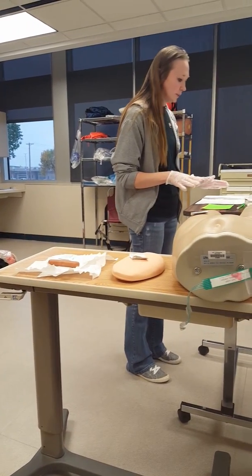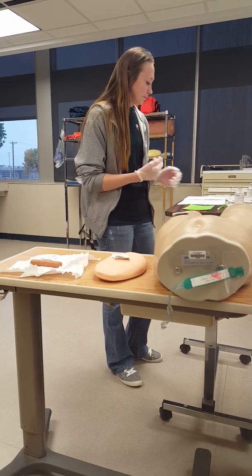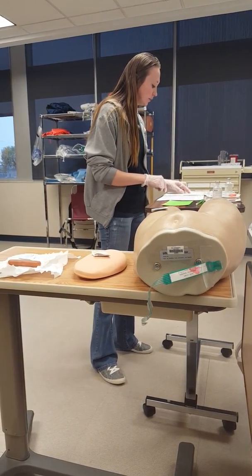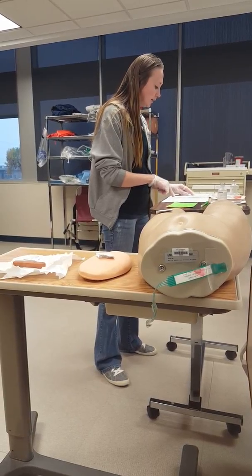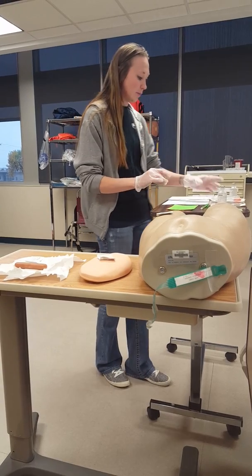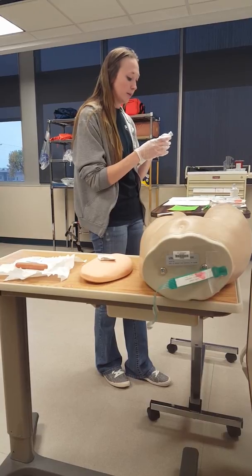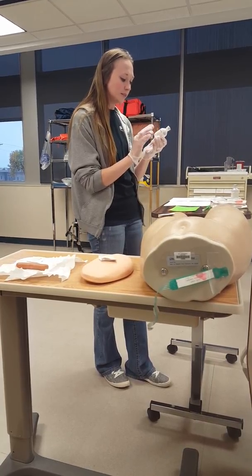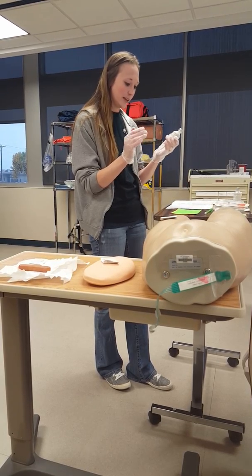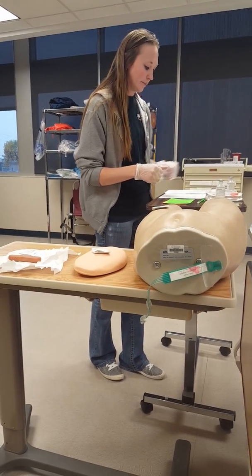I'm going to be doing the tuberculin first on you, and I'm going to check my doctor's order to my MAR to make sure that's what I'm giving you. So I'm going to be giving you tuberculin 0.1 mLs, and that matches up. I'm going to look at my vial here, and it says tuberculin 0.1 mLs, and it's not out of date, so that's good. And the integrity of the bottle is good, so that's all good there.